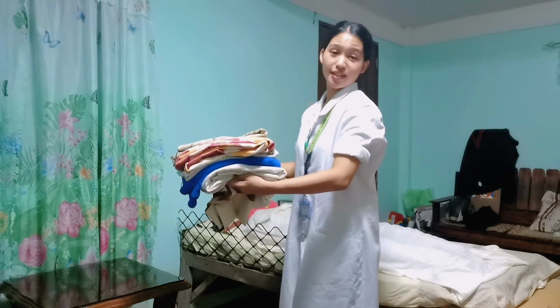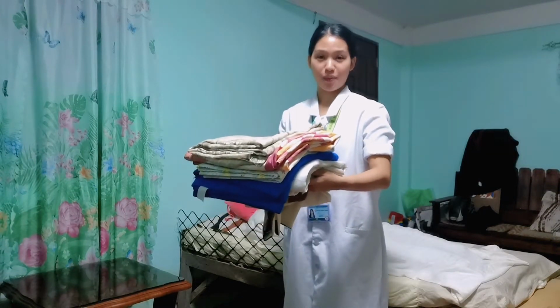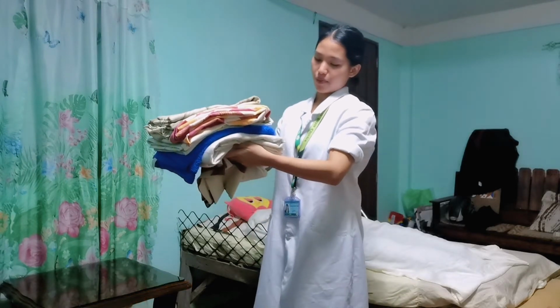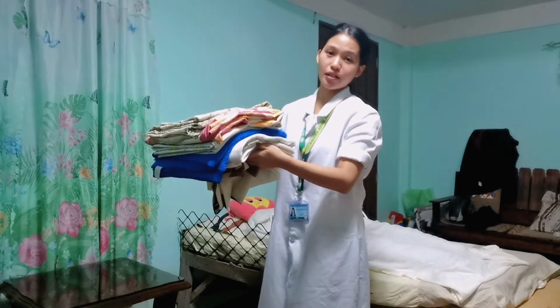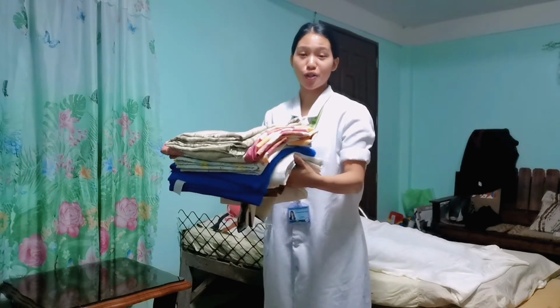Again, make sure that the clean linens are not touching your uniform to prevent contamination. And before gathering, you must place all the linens in order for it to be easier to put the linens accordingly.